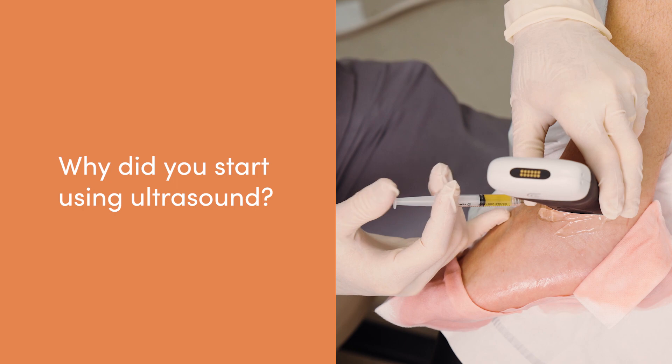A long time ago, I started using ultrasound because although I did a lot of courses to help me learn how to do blind injections or palpation-guided injections, I was nervous. I don't have an emergency room background. I was really nervous that I'd hurt somebody. And I saw ultrasound as a way to improve my safety, my comfort level, and my patient's safety.